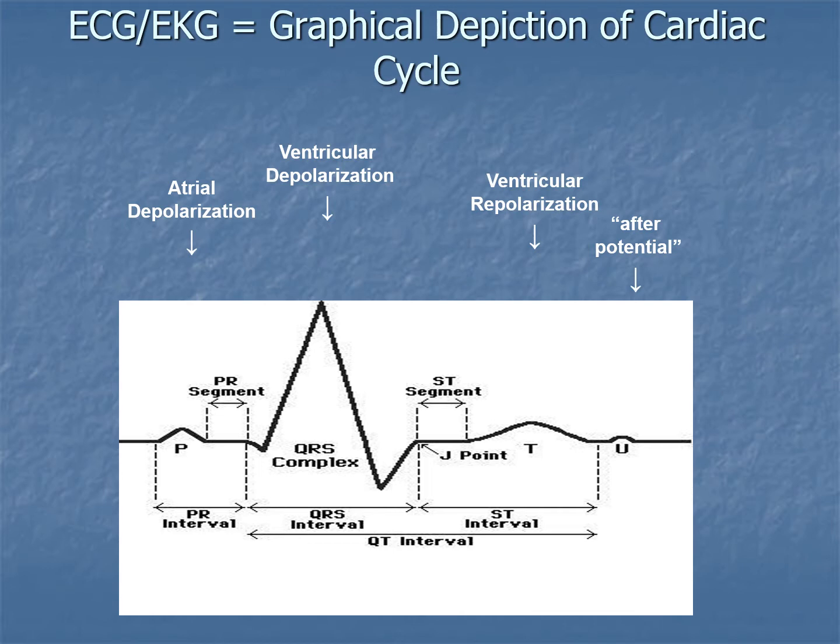And you'll see as we describe these abnormal dysrhythmias, if you will, a lot of them have to do with an abnormality in the shape. It could be in the interval as far as a prolonged interval. It could be where P waves sometimes are buried in QRS waves or just not visible at all. So now let's focus a little bit more on the rest of this presentation.